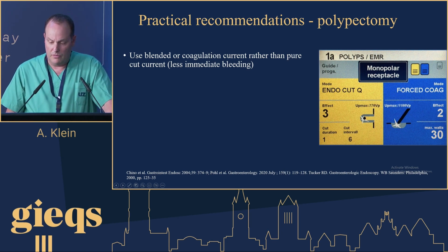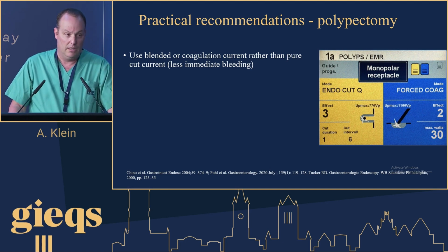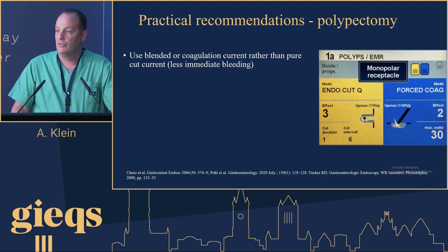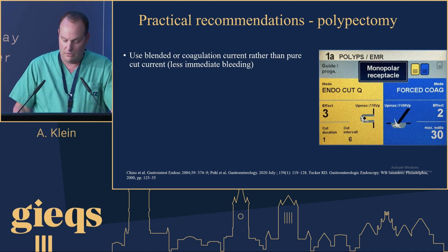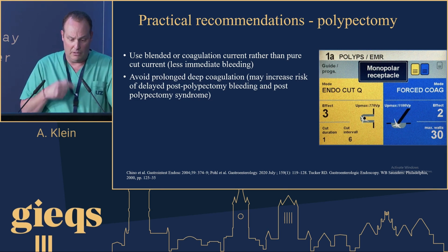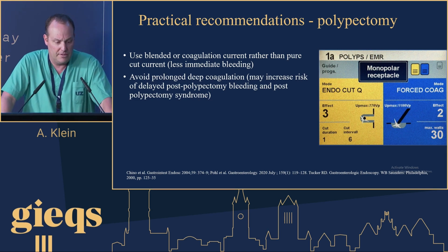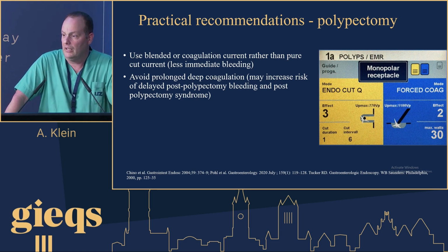You can also use the forced coagulation mode, which gives you more coagulation but does give you some cutting, and that may be helpful in large pedunculated polyps with thick stalks, so you can get some more coagulation effect during your resection. You need to try to avoid deep coagulation, because if you do that, you can increase the risk of a delayed post-polypectomy bleeding. But the coagulation has advantages, because if you use just pure cutting, you can get immediate bleeding, and that's undesirable.